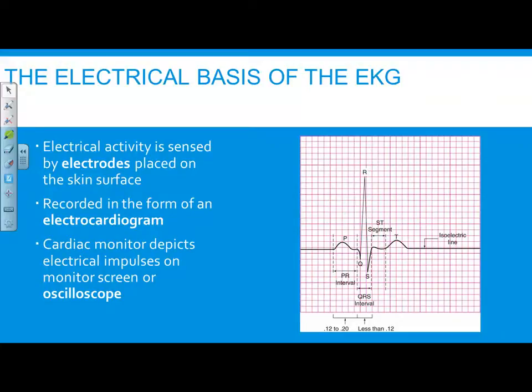But if you see the monitors that they use, from time to time when they show it, it looks like a seismograph that they detect earthquakes with, where it's just a needle that burns a little line on paper. So that's really what the oscilloscope is. It just went to digital now. All right.